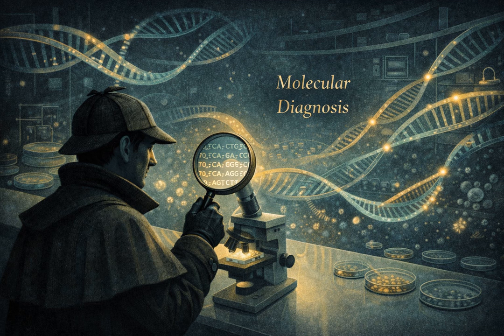Now we need to move to Section 3, reading the blueprint, nucleic acid analysis. This is where we stop just asking the question, is it there? And we start asking exactly, who are you? And the absolute star of this show, the workhorse for bacterial identification, is the 16S rRNA gene. It's often called the barcode of bacteria. It's a perfect name for it. Every single bacterium has ribosomes to make proteins, so every bacterium has the gene for the 16S component of the ribosome.